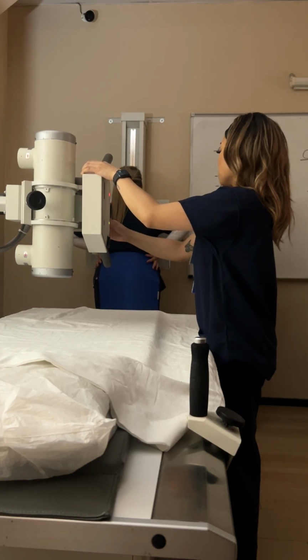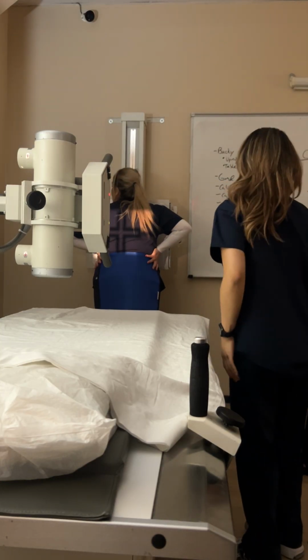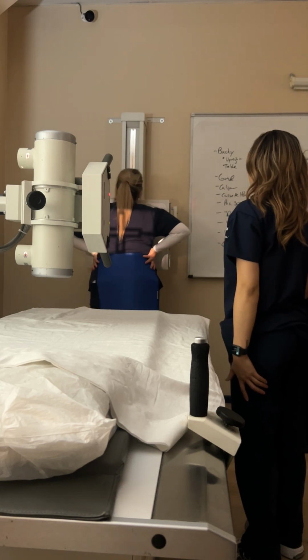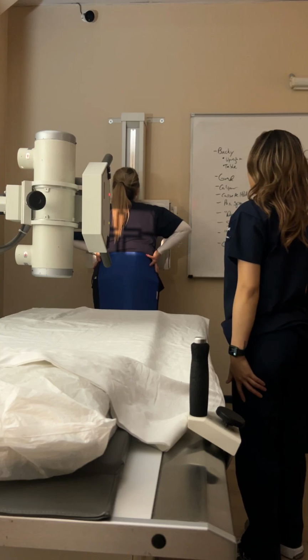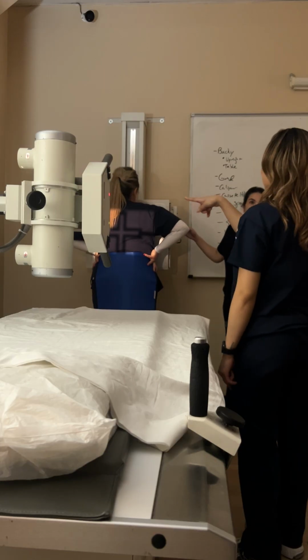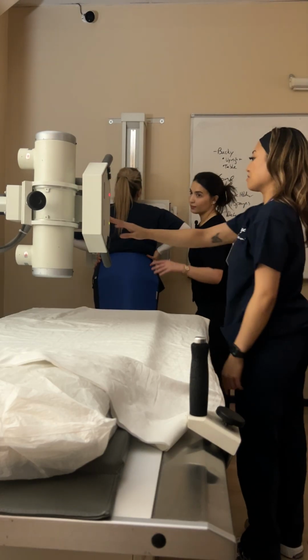So that's what you mean by setting up beforehand? Yeah. A lot of the times you're still going to have to adjust, but you just want to have everything in the room. Sometimes you won't even have the shield in the room. So just make sure you can detent this and then go get the patient. I just thought it was more left, that's why I thought it was off.